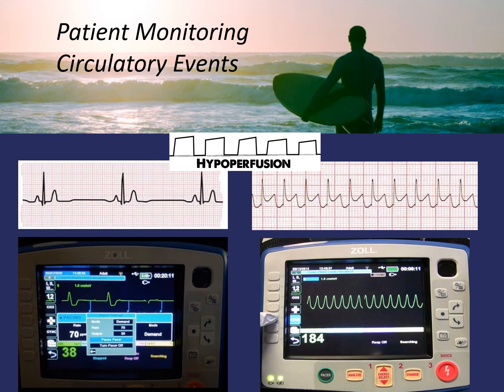For example, on a symptomatic bradycardic patient that you've begun pacing, you'll observe an increase in the end-tidal CO2 with mechanical capture.